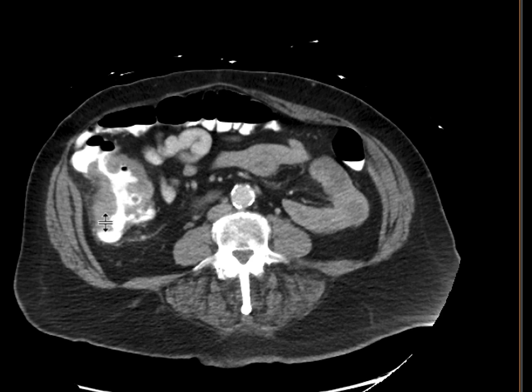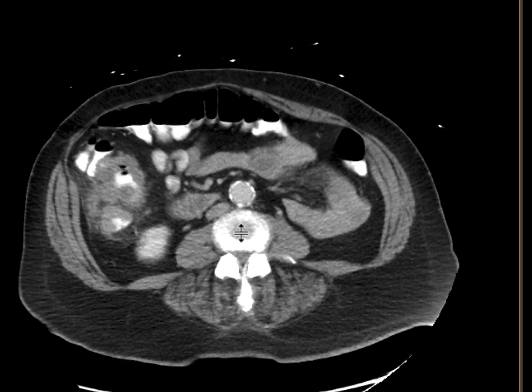Look at the attenuation in the wall — it's soft tissue attenuation. It doesn't quite have a target sign that can be seen with bowel inflammation. And so this finding would be very worrisome for an ascending colon neoplasm.